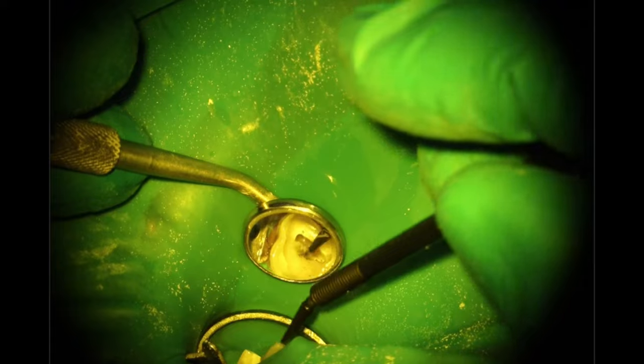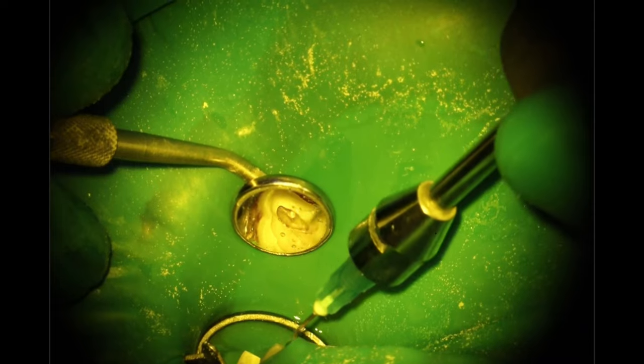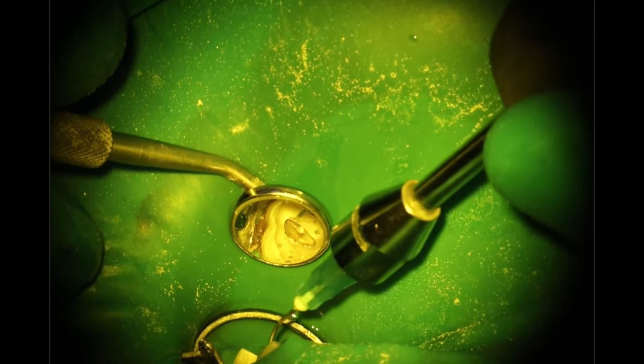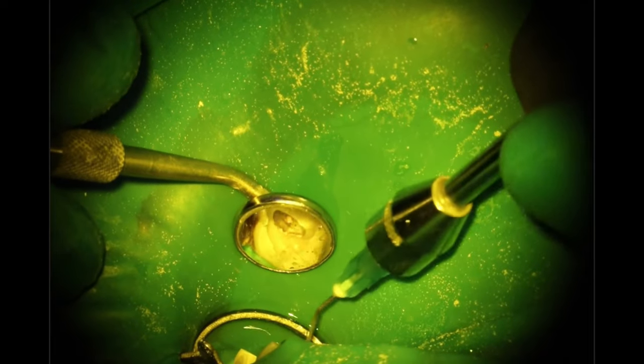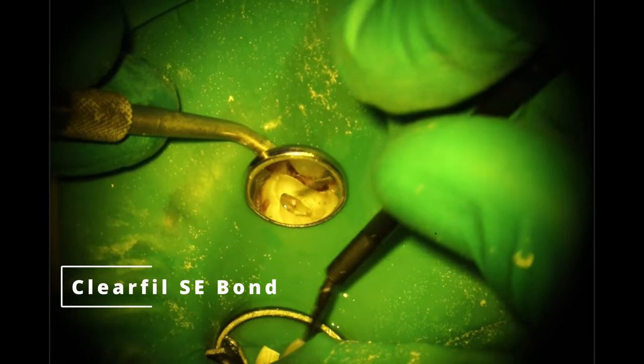At this point basically everything's done — I'm just patiently waiting. I'll tell her when I think I'm going to need more. This was a larger case, and sometimes one micro brush isn't enough to fully get all of that dentin nice and saturated. So while I'm air drying this, she's going to get the bonding part ready to go. One thing to note for assistants watching: if I ask for it twice the first time, I'm going to need it twice the second time. That's a good lesson to learn — just be prepared.